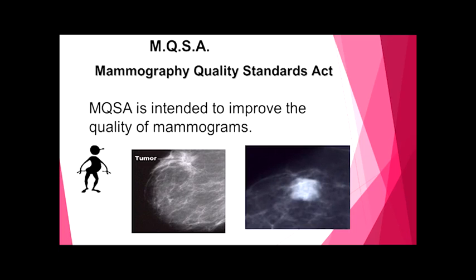We certainly have improved the quality of the mammogram, the procedure that we're providing the patient, and the interpretation that the physician is providing. All of those things have come together, and what we see today is certainly improved over what we saw many years back. And even when you look at films done today and compare them to mammograms that were done last year or the year before, we can see that the quality of the image has improved.